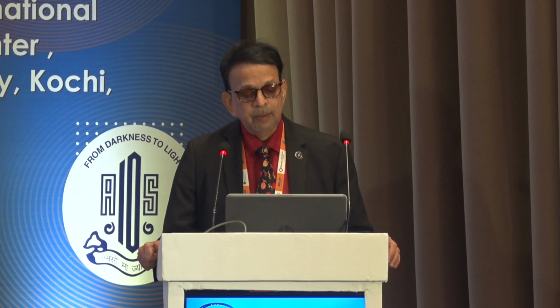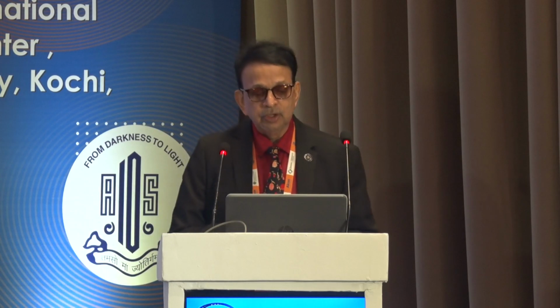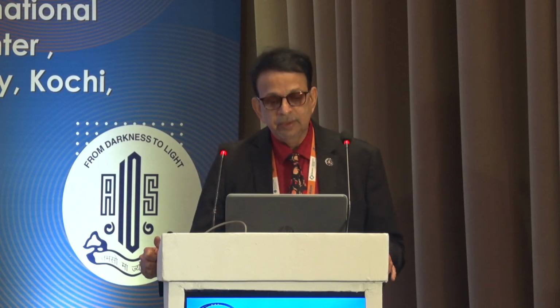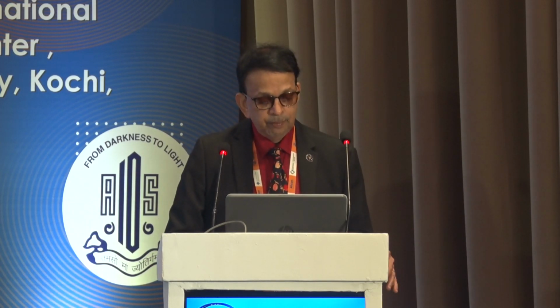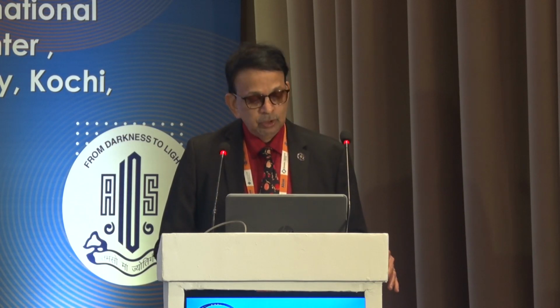It's a mature cataract, so it has gone through and it has cut. The rhexis is already done, and I'm just supporting that area of the zonal weakness. I put the CTR as late as possible because I don't want the CTR to trap the new epinucleus and the cortex there. In this case, the zonal dialysis was only about 3 or 4 clock hours. And you can see here, I just have to pick up the nucleus because already it stopped there, and I don't put much stress on the bag because already the bag is very weak because of the zonal dialysis, and the rest is very, very easy. And then at the end of the surgery, I remove the cortex, and then put the CTR and put the MA60 lens.